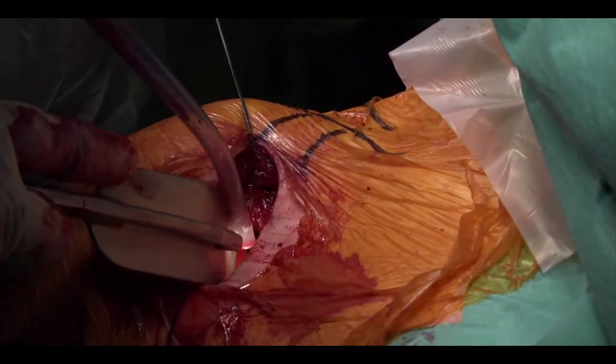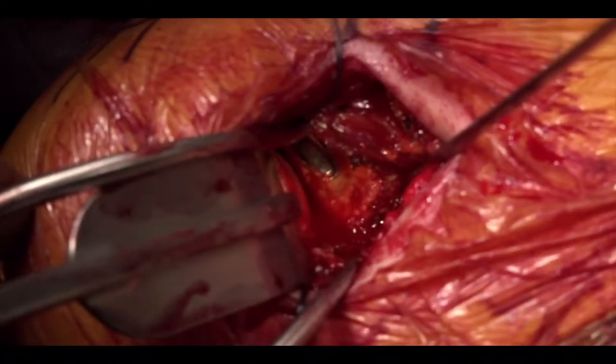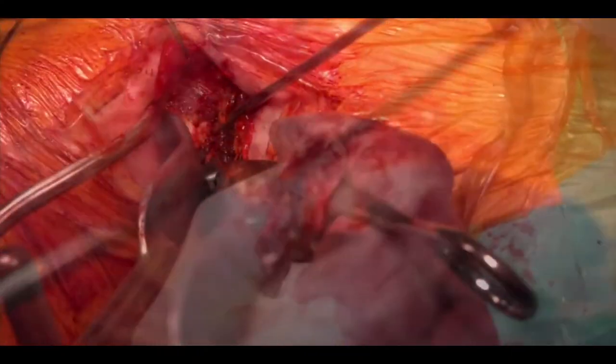A subscapularis split is made, the capsule held with retaining sutures and the anterior glenoid nicely decorticated. The half-slit cannula is then introduced posteriorly and the drill guide arm shuttled over the top and positioned on the front of the glenoid.